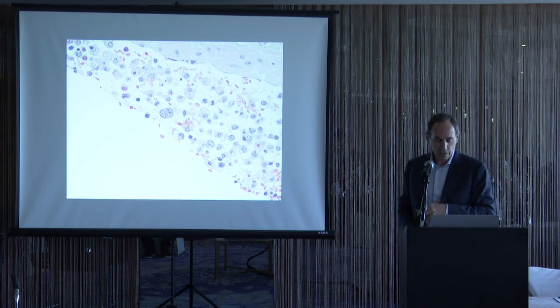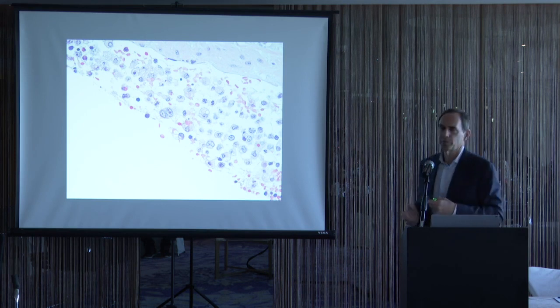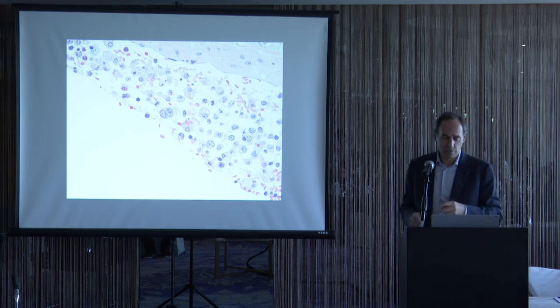But when you look a little bit more carefully, most of these look like histiocytes, but you have to say, what is this cell? Could that be a histiocyte? Could that be a tumor? Maybe that could be a histiocyte, could be a tumor. In cases where you're not sure, then you should be doing stains, for example, OCT3/4.